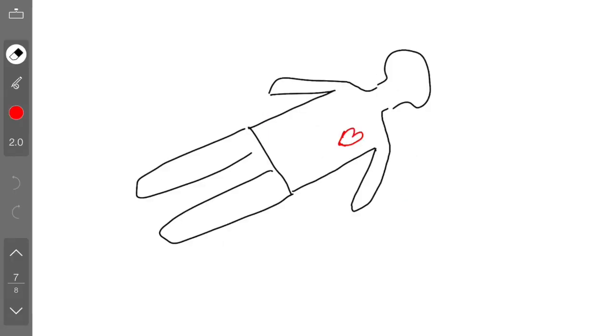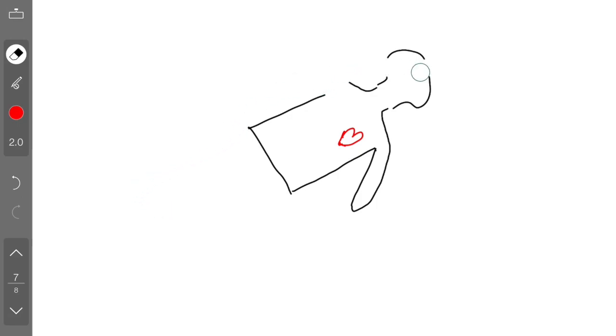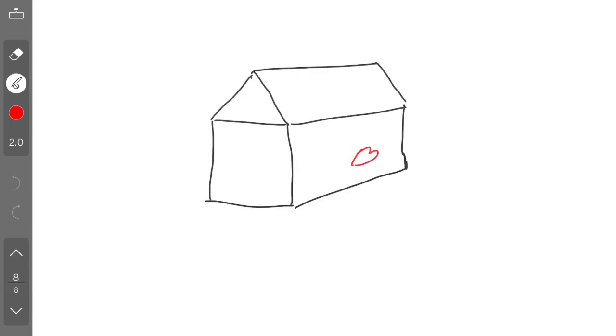By this time you would be knowing the house which I used to show to represent the trunk of the patient. Same way here I want to say the same thing. We're going to draw the same diagram of the house and we'll represent the chest leads on the house. I'll just remove the legs and the hands and we'll be representing this trunk as the house.